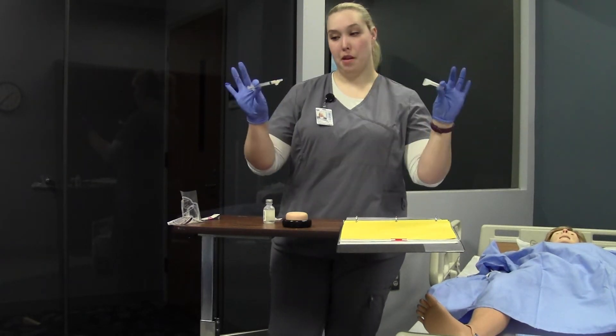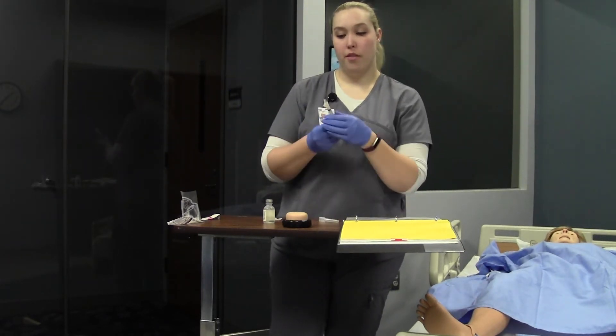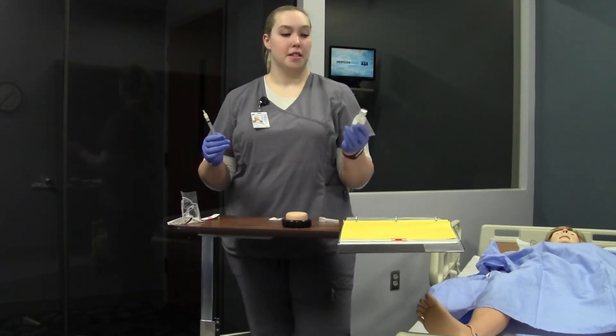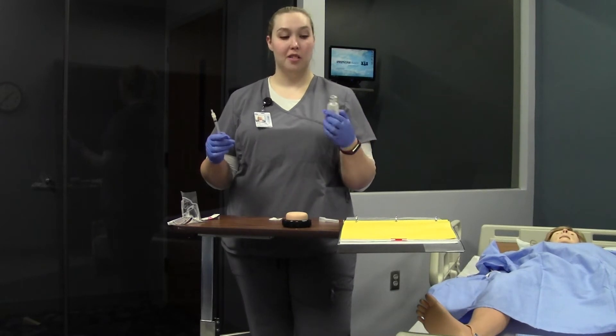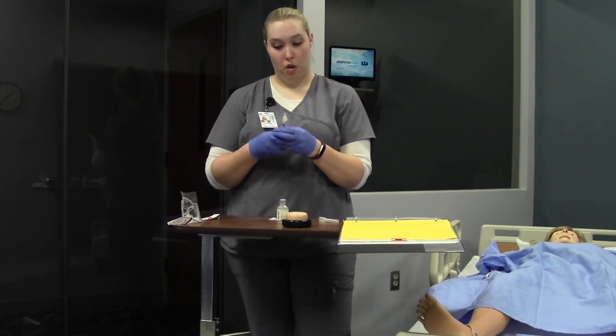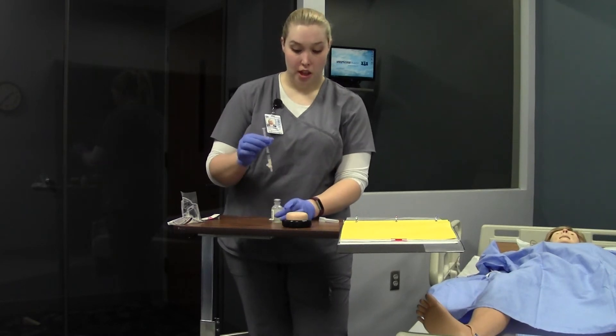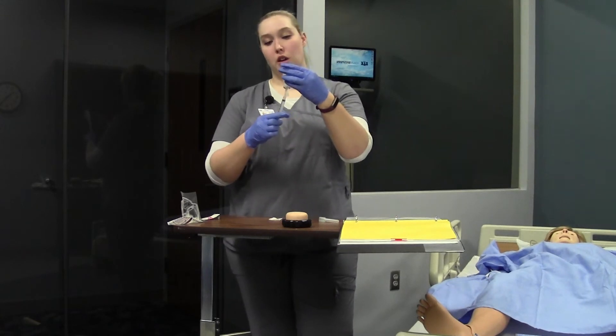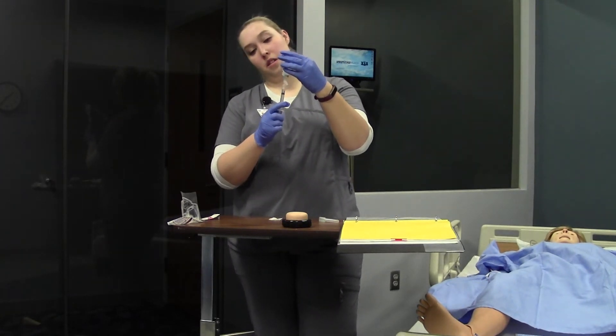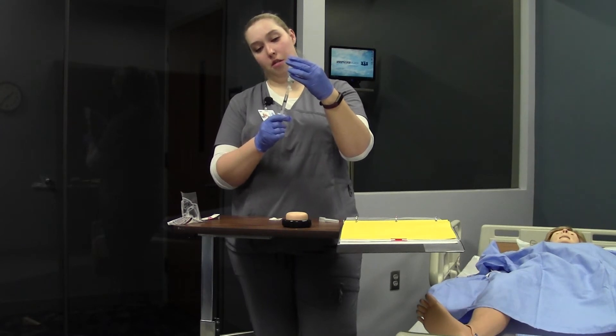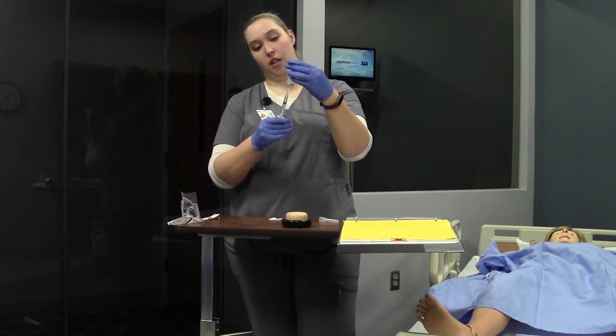And then when I'm uncapping my needle, always pull away from me. 5,000 units sub-Q. I'm going to check my label. It says 5,000 units per mL, so that means I'm going to draw up one milliliter. So one milliliter of air. The top of my vial is cleaned already. I'm going to inject and draw up one milliliter. I'm going to draw just a little past due to the fact that I have a little air bubble in there.